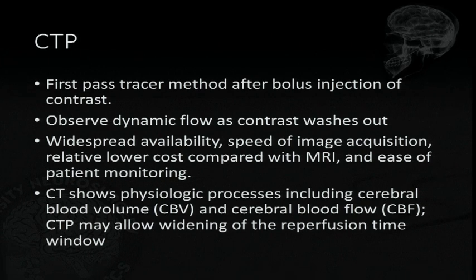I tried doing an MRI Saturday, and it took me 2 hours to get the patient, 1 hour to get the tech here, 1 hour to 30 minutes to get the patient down to MR, another hour to do the MRI. So we're not doing MRIs for acute patients. Okay, so CT, with very specific cases that we'll talk about at the end.